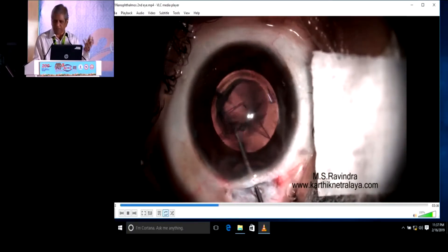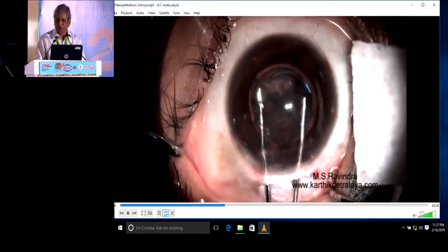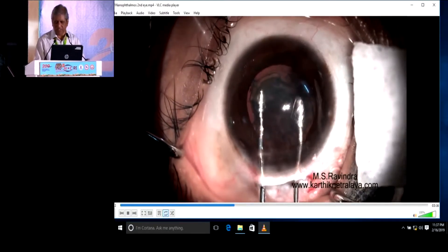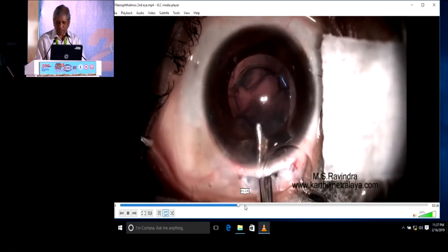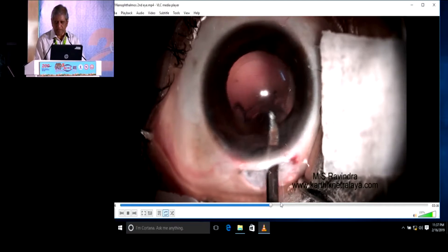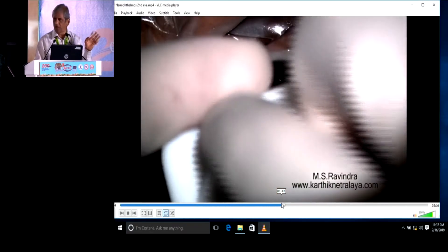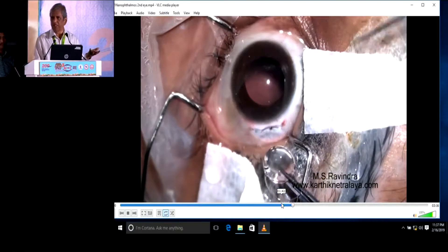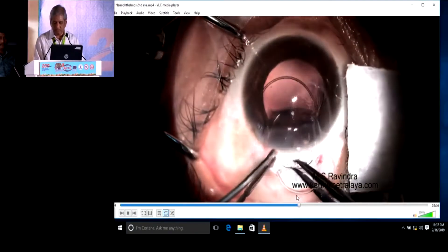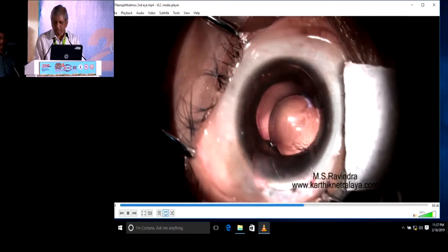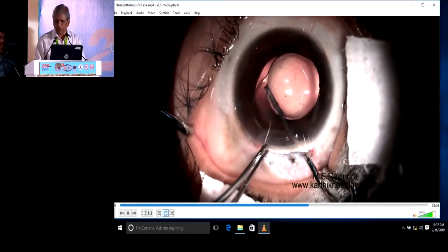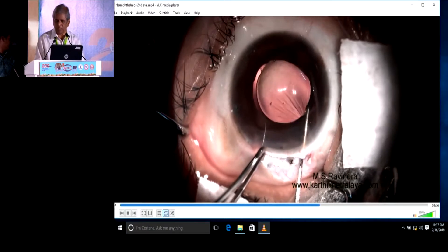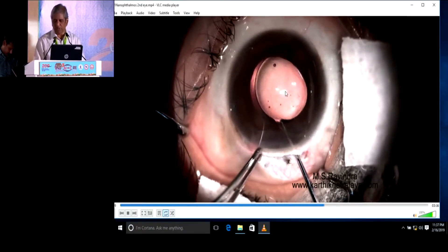The corneal diameter is just about 10 mm or less — it is a very small eye. I could get a good rhexis; it didn't run off just because I adopted the tunnel floor entry technique. I had developed a special lens for her, which is 60 diopters in power. That's probably the first time a lens of 60 diopters was implanted in a human eye. Being a soft cataract, I could churn it and aspirate it with two instruments. There is no positive pressure at all during the surgery — that's an attribute to the no-injection technique.